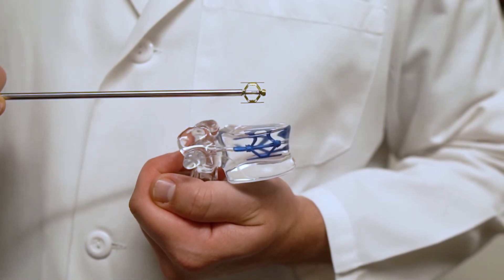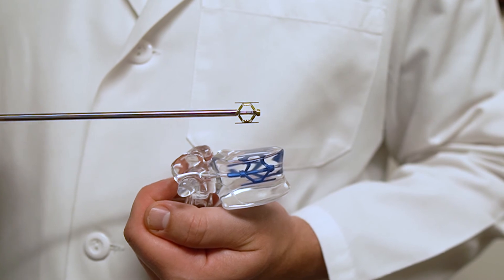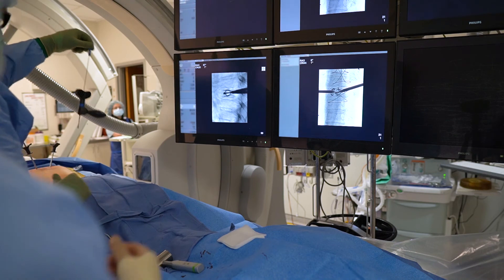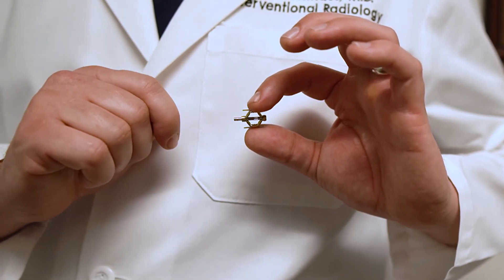As you can see here, the implant will go into the vertebral body and restore the height. Once we've deployed the jack fully, we'll release it and inject cement to secure the implant in place.